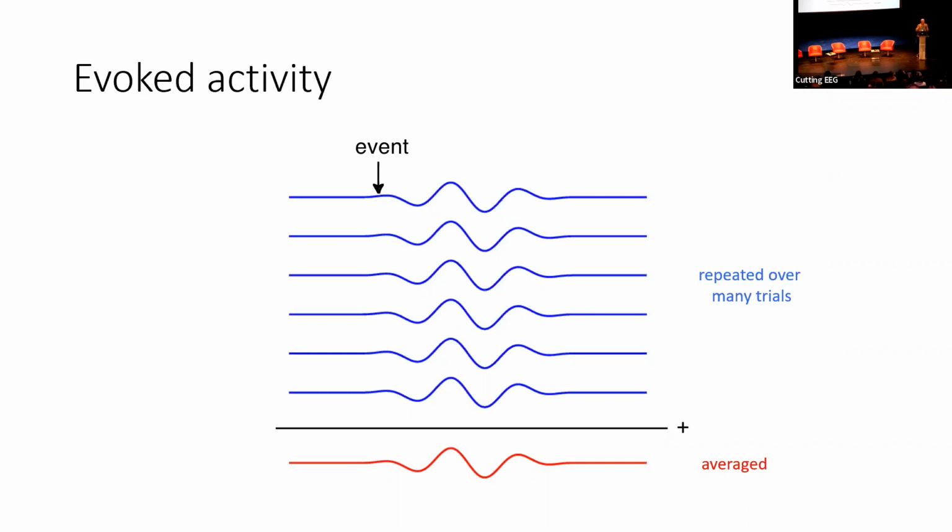Getting extra trials within one participant is usually cheap. Putting on a cap takes you half an hour or so, and instructing, inviting, and finding the participant usually takes even more time. So getting one participant might be a few hours of work. Getting a few more trials is cheap; it only takes like 15 minutes. So that's where the trade-off often comes in. To be honest, at the Donders we often have the strategy that we try to exhaust each of our participants that comes in the lab.